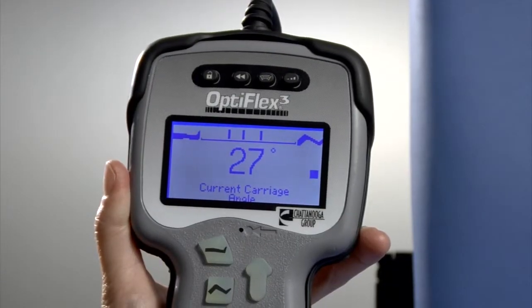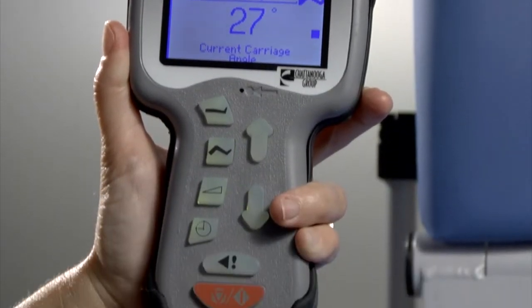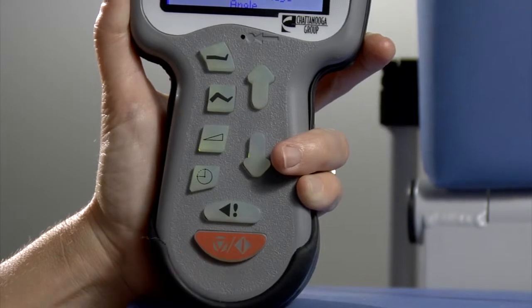The red button at the bottom of the hand control is the start-stop button and will perform both of these functions.